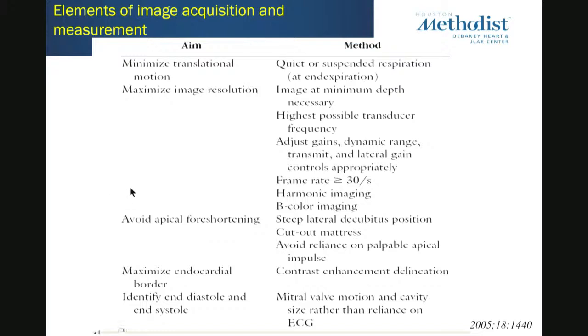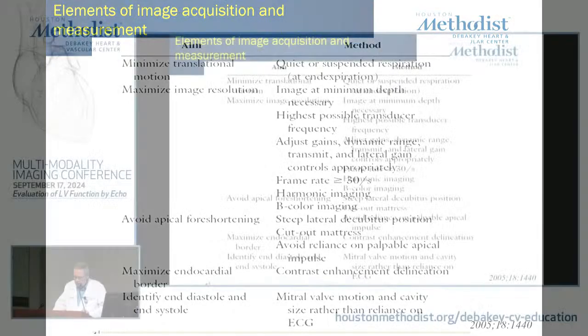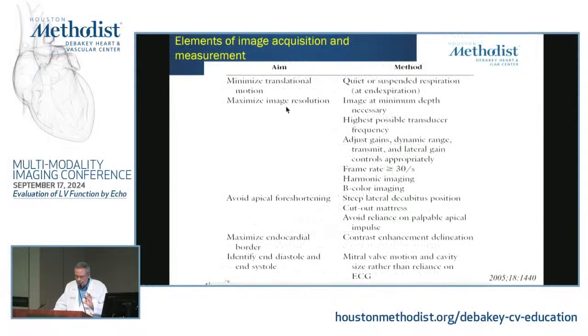These are coming from that guidelines article. You want to minimize translation by having the person breathe easy and not have a lot of big inspirations. You want to maximize resolution by using the minimal depth possible, the highest frequency. Nowadays, a lot of these settings are automatically done by the machine, which is wonderful for those of us who are not doing it every day and don't have all the experience.